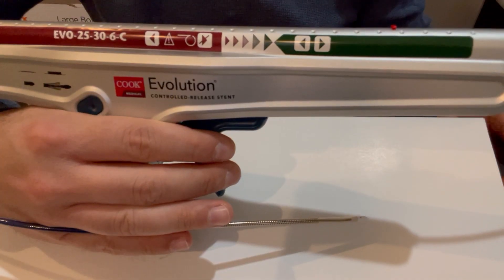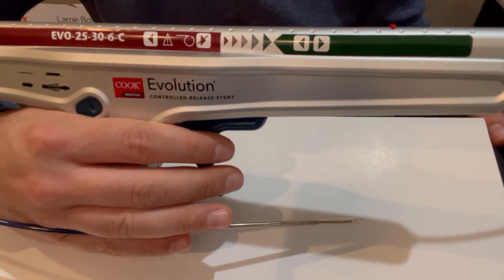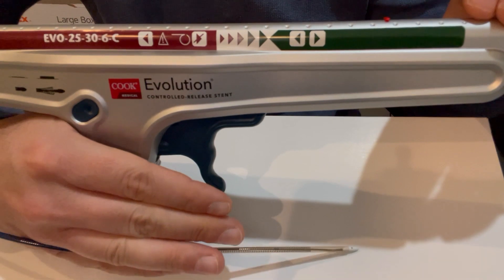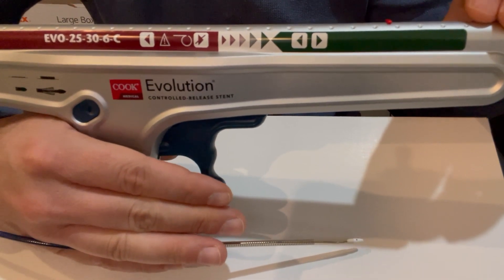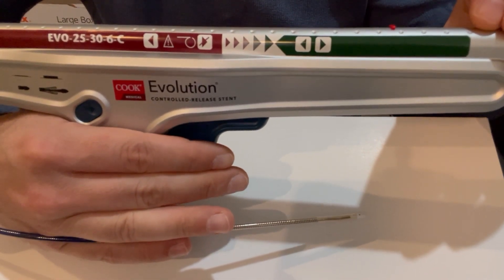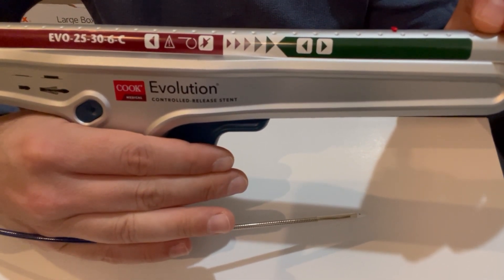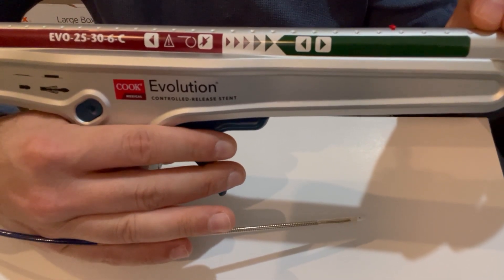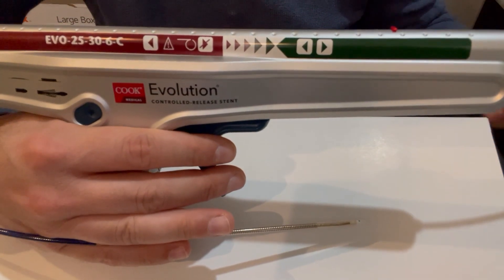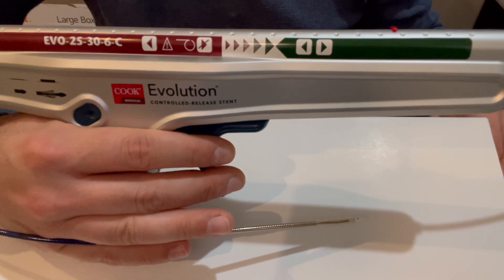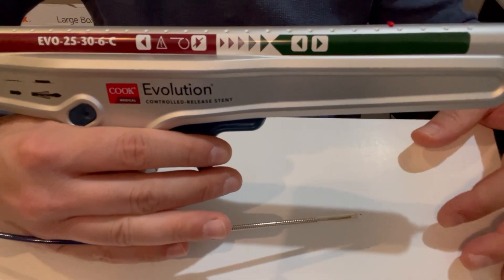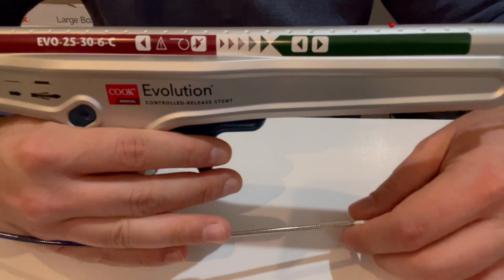So this is the deployment system. It's a gun-style self-deployment system that is 10 French compatible, 0.035 wire compatible, with a 250 centimeter shaft, super long, obviously designed for the colon.